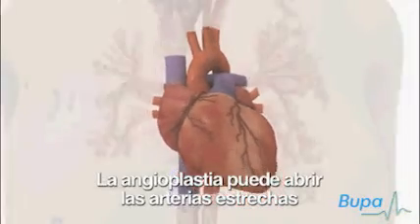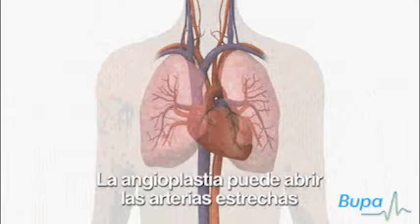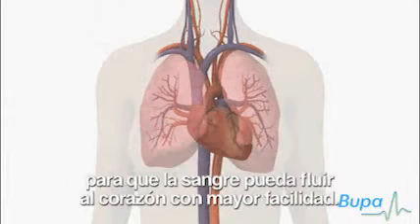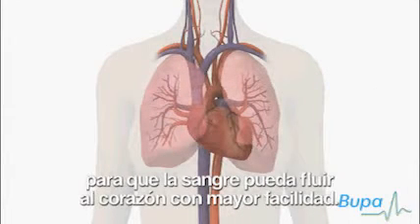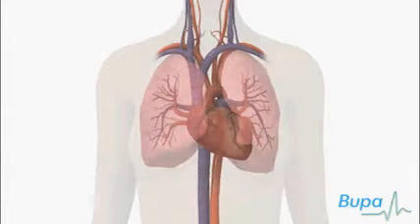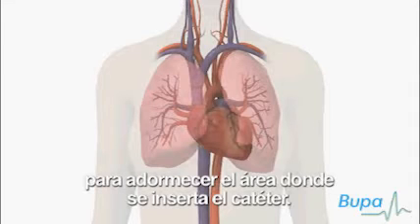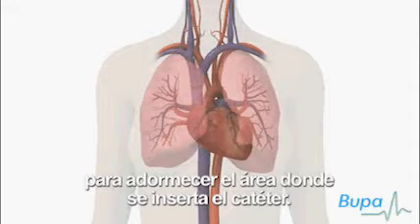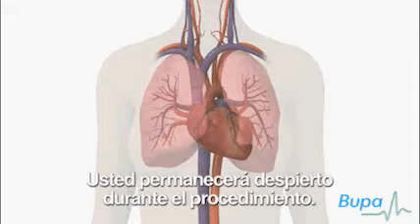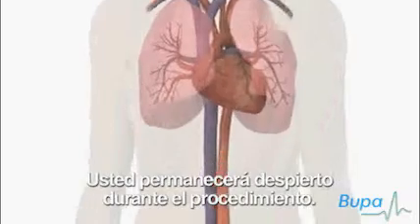Angioplasty can open the narrowed arteries so blood can flow more easily to the heart. Angioplasty is normally carried out under local anaesthetic to numb the area where the catheter is inserted. You will stay awake during the procedure.